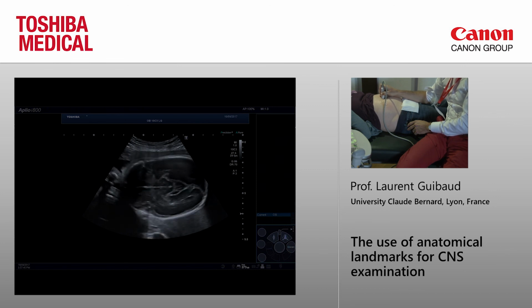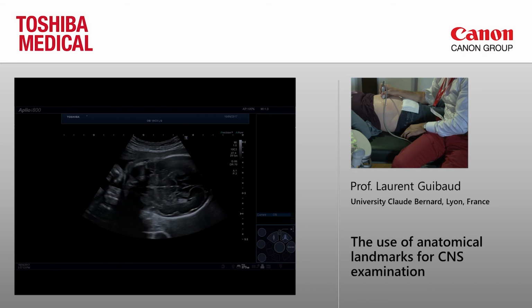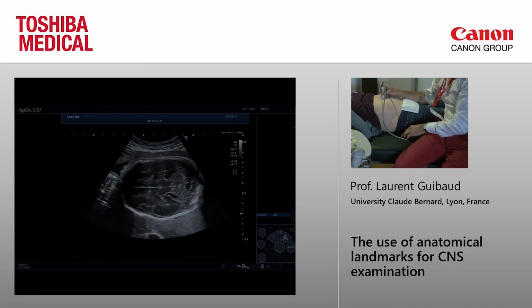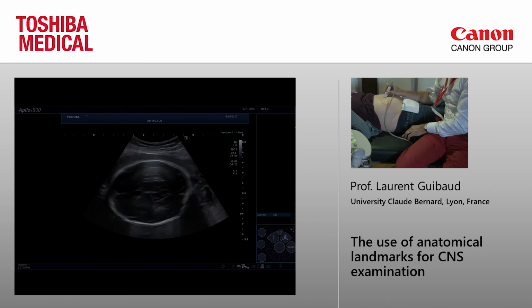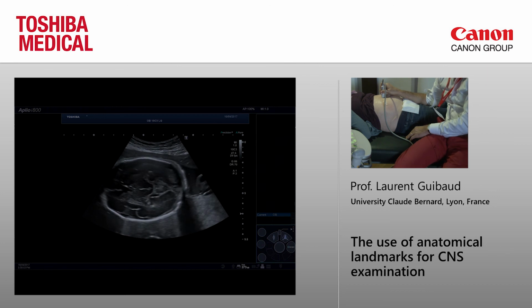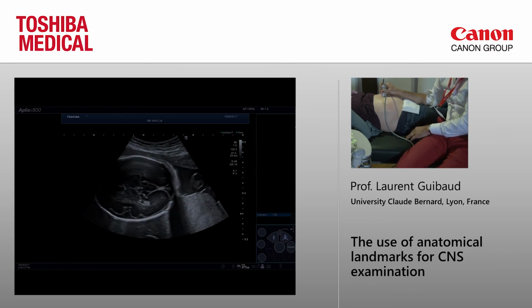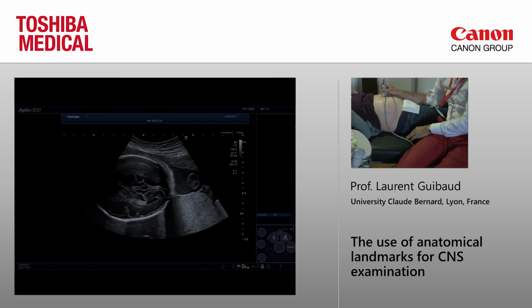Don't hesitate to ask. Mr. Guibaud, is it possible to see the signs of CHARGE syndrome? Yes. The frontal sulci, the olfactory sulci, and the ear, the internal ear. Yes, it's very difficult to see at this age of pregnancy because at 26 weeks it's not possible. So the inner ear will be, in fact, identified by MR at this age of pregnancy.